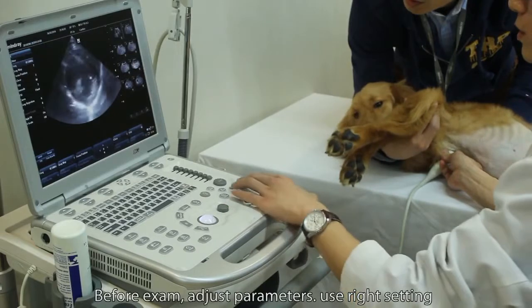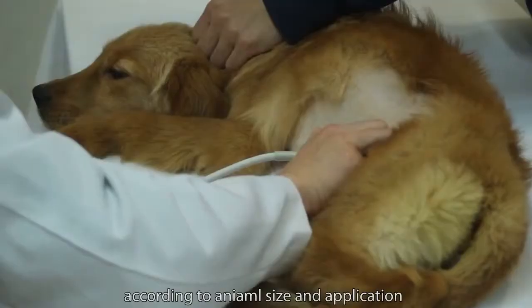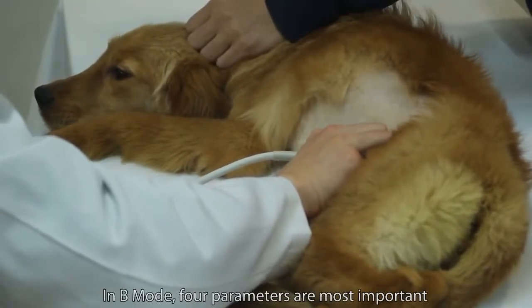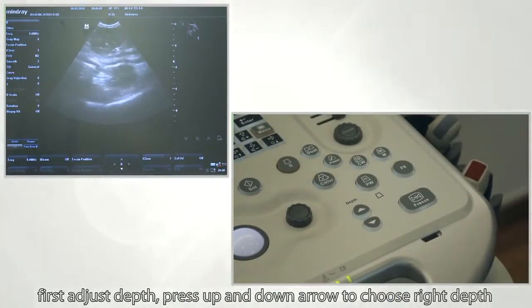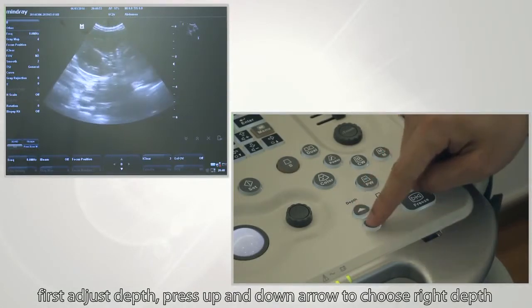Before conducting the examination, adjust parameters and use the right settings according to animal size and application. In B mode, four parameters are most important: depth, gain, frequency, and focus. To adjust depth, press the up and down arrows to choose the right depth.